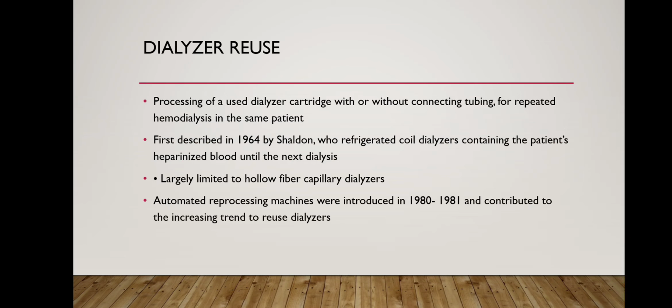It is largely limited to hollow fiber capillary dialyzers, and automated reprocessing machines were introduced in 1981 and contributed to the increasing trend to reuse dialyzers.